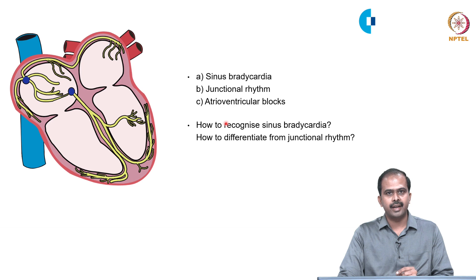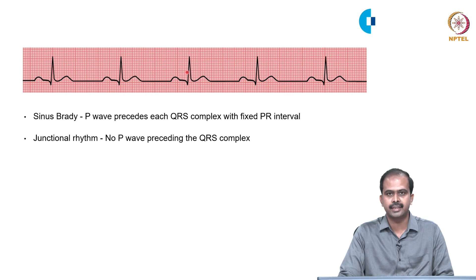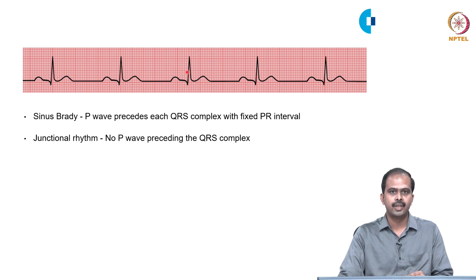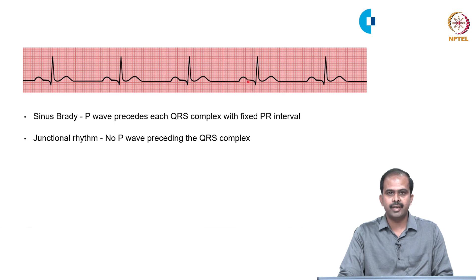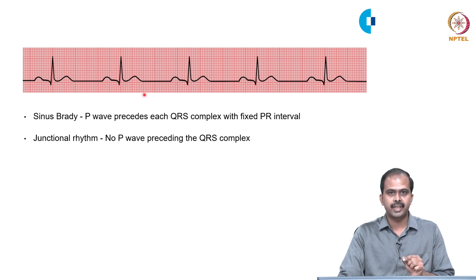In this ECG, let us first calculate the rate by tracing the R waves. Between two R waves there are 6 big boxes, so 300 divided by 6 equals 50. The rate is less than 60, so it is bradycardia. To confirm it is sinus, there is an upright P wave preceding each QRS complex with a fixed PR interval. This is an example of sinus bradycardia.